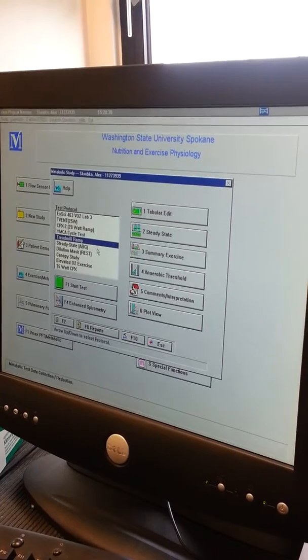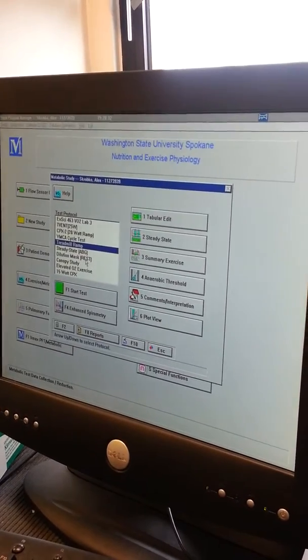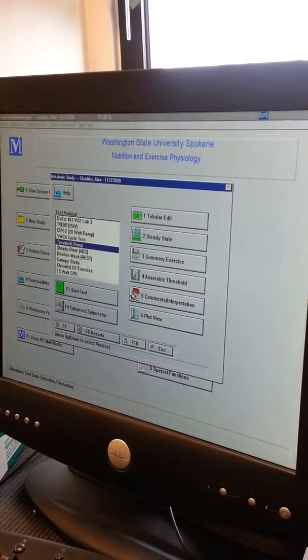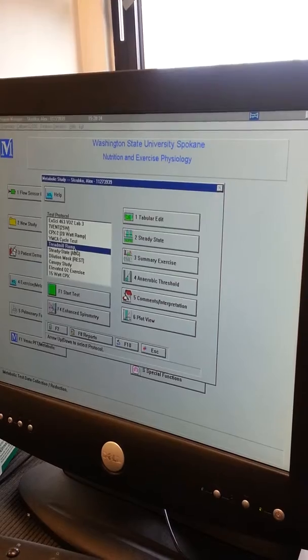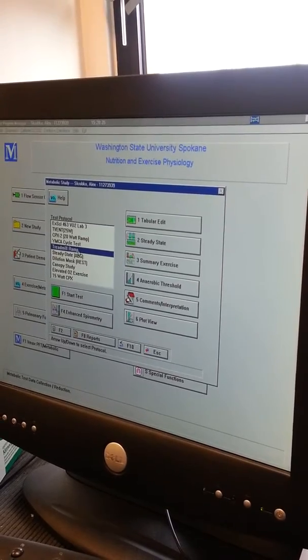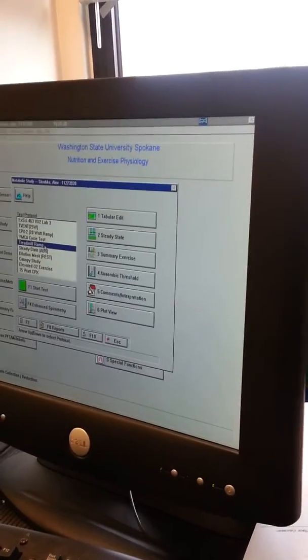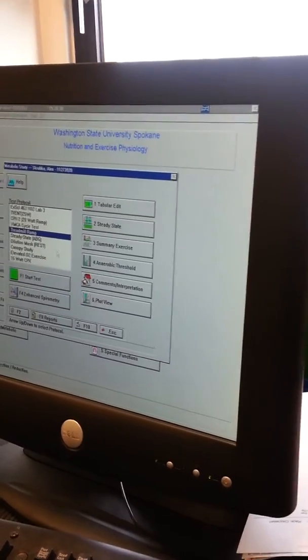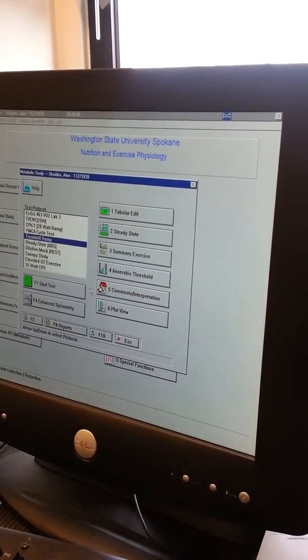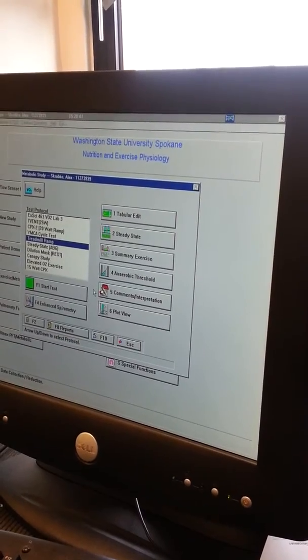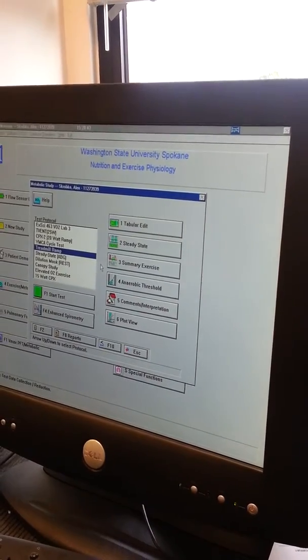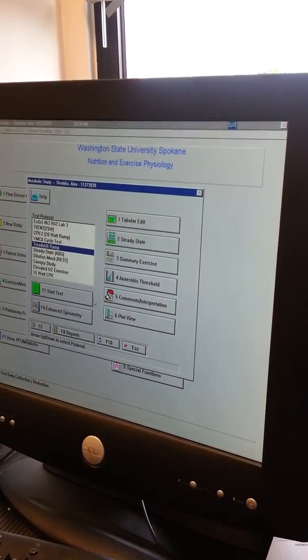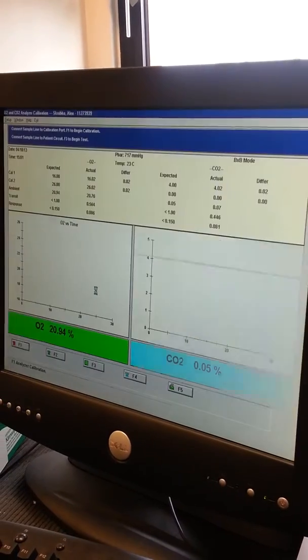We are doing the modified Balke, is that right? Yeah, so do we select treadmill ramp? Yes, correct. Treadmill ramp - it should already be selected. Okay, and then what, start test?